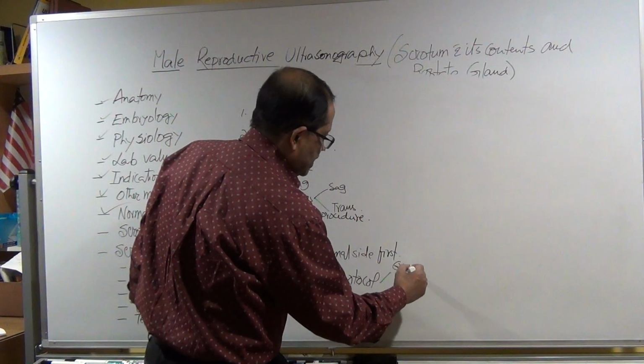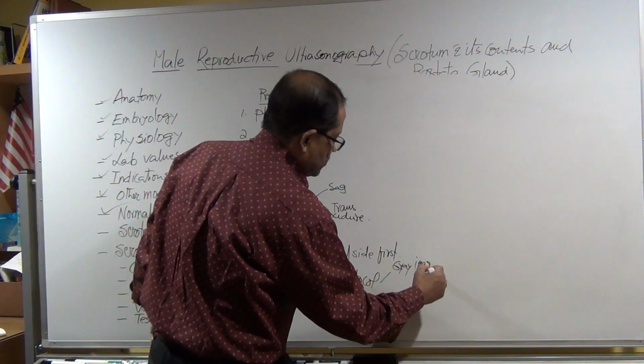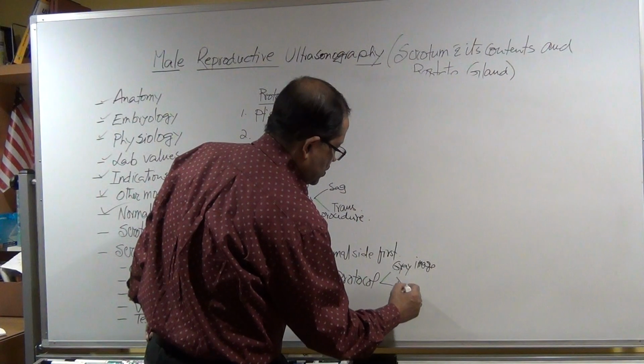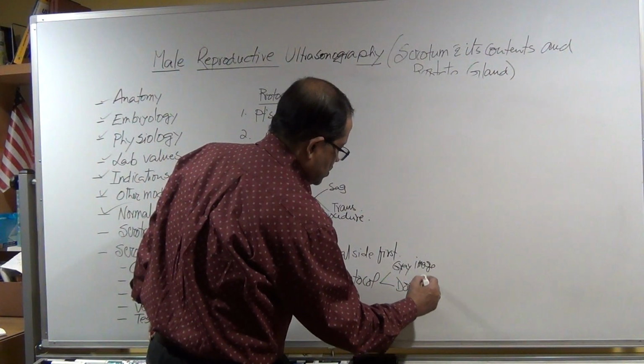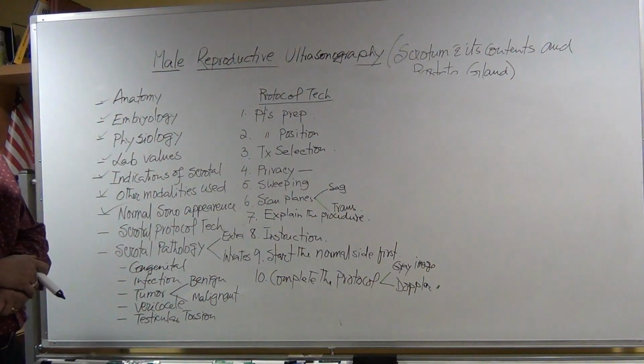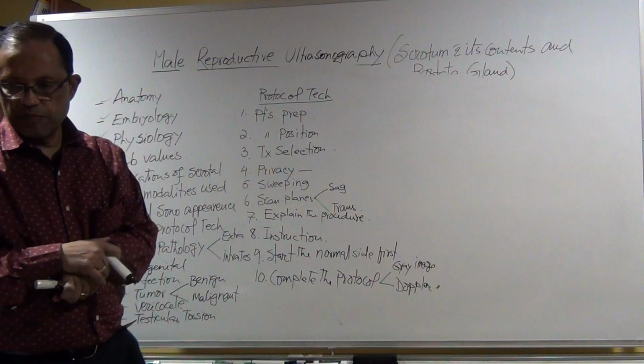You will take the gray images and the Doppler images. Did you scan the scrotum? Mm-hmm. Good.